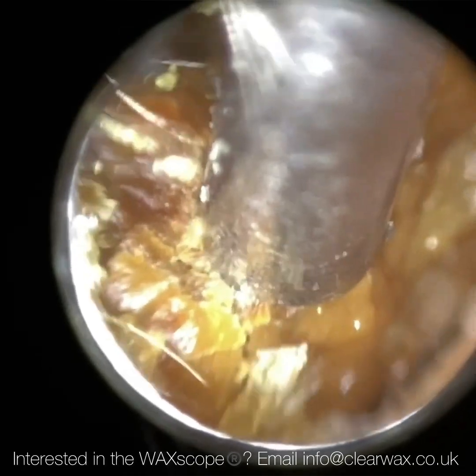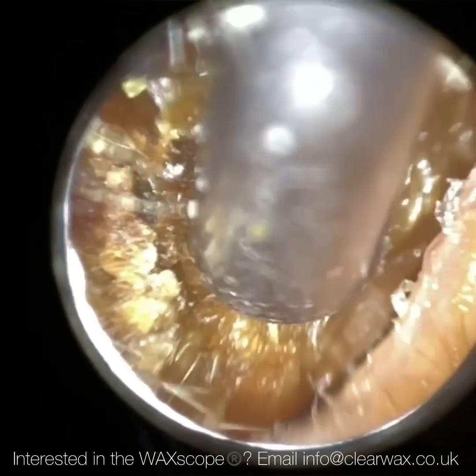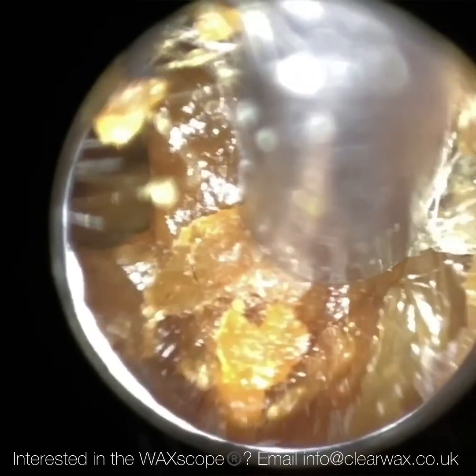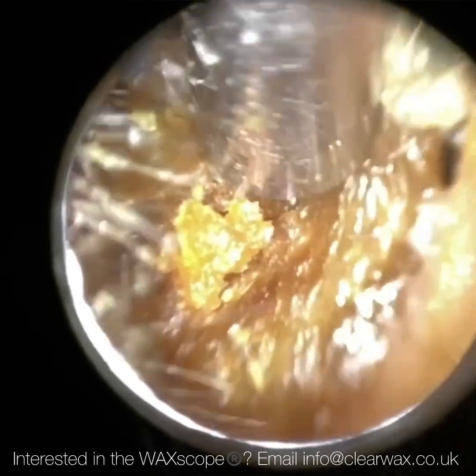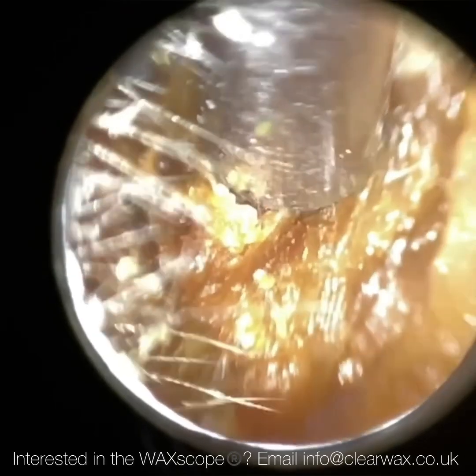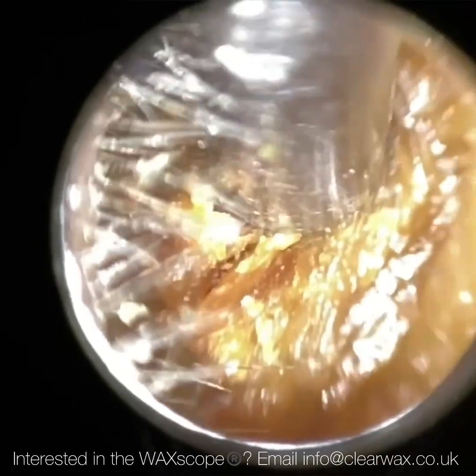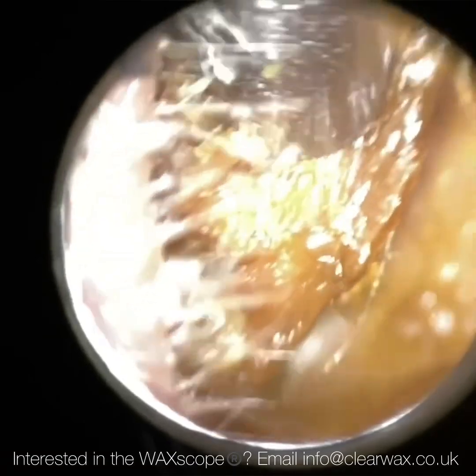The problem with the endoscope, however, is it doesn't matter how good the view is if people can't use it, and unfortunately most people who attempt to use an endoscope really struggle. So that view is redundant. And when people can't use an endoscope, what's happening at the moment is that they're reverting to loupes like I've just demonstrated. The problem with loupes is not only the body posture, because your head is leaning forward so close to the patient's ear to be able to see anything, it's the poor magnification.